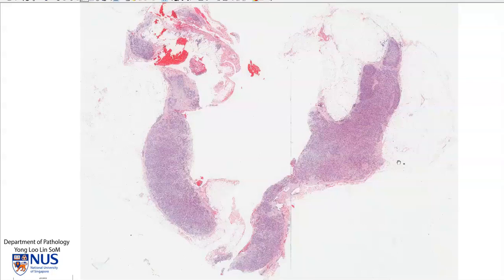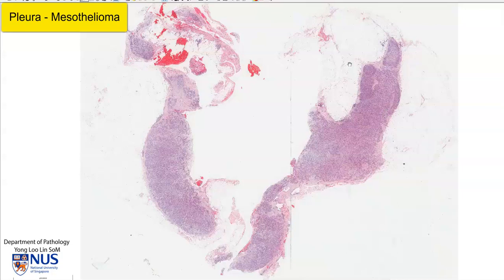This is a virtual microscopy slide of a malignant mesothelioma of the pleura. We can see here two tissue pieces of parietal pleura, and it is very abnormally thickened by tumor.